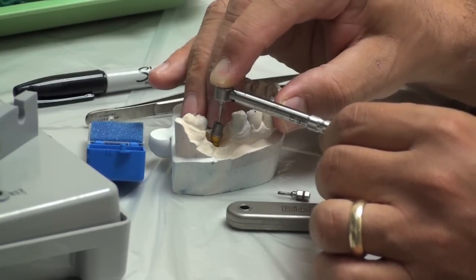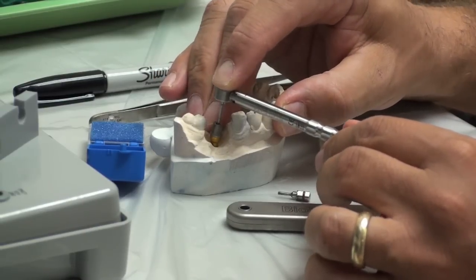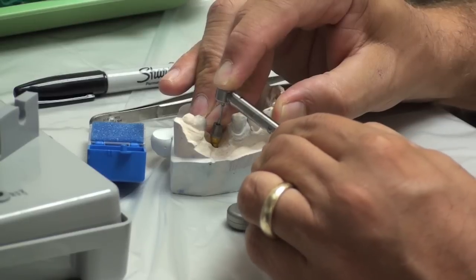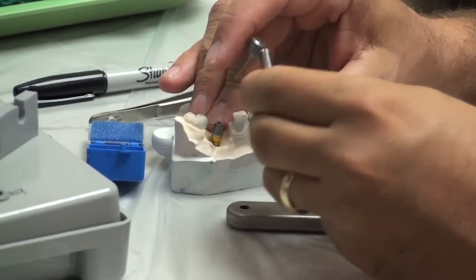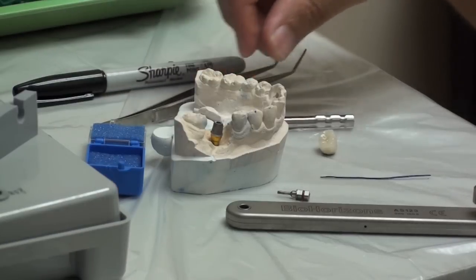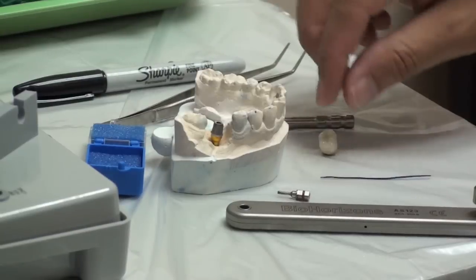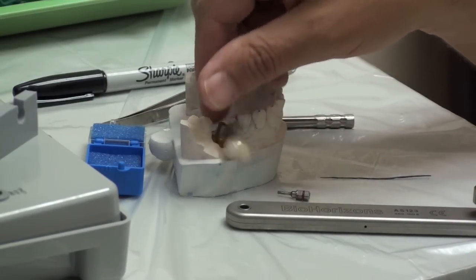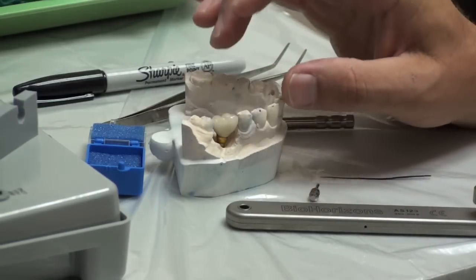So we're going to torque it down - I'm tightening it. It's no longer turning. I'm feeling the pressure building, keeping it pressed down. And boom, it breaks. It's important to do that because that torquing will seat it a little bit more than you will do it by hand, which in turn will make the crown seat down a little bit more. And so when you adjust your bite, you'll have a correct bite.